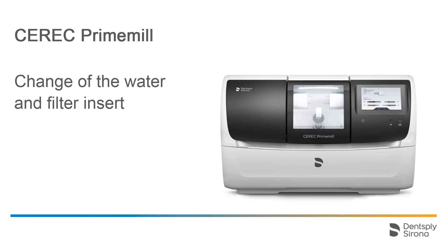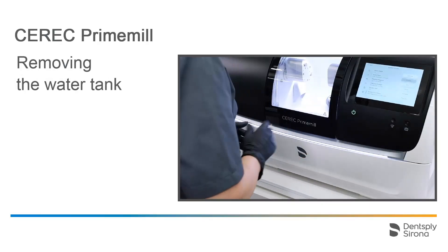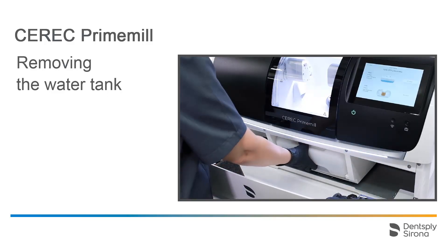Welcome to this video tutorial on the topic of CEREC Prime Mill. In this video, we will demonstrate how to change the water and the filter insert. The water tank is located in the compartment below the chamber. The tank can be removed simply by pulling it out.